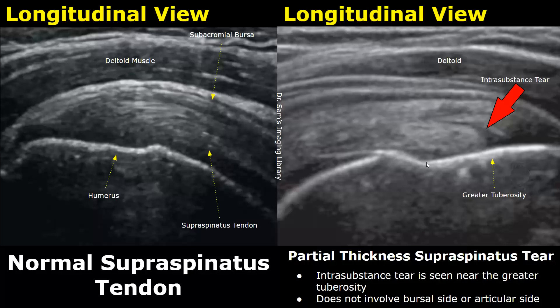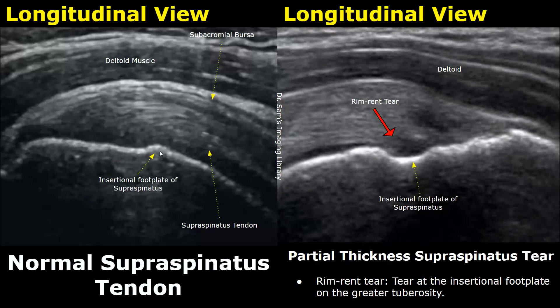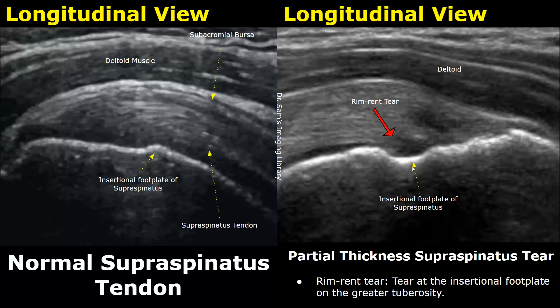This is an intrasubstance tear. It occurs near the greater tuberosity of the humerus and does not involve the bursal side nor the articular side of the supraspinatus tendon. This small bulging area on the greater tuberosity is called the insertional footplate of supraspinatus, where the tendon attaches. Any tear seen at this location is called a rim-rent tear, and it is also a type of partial thickness tear.